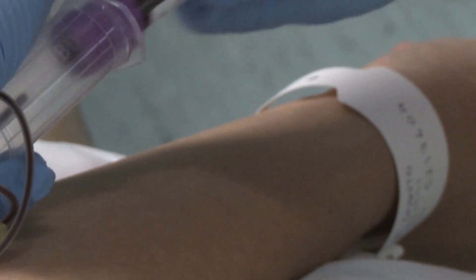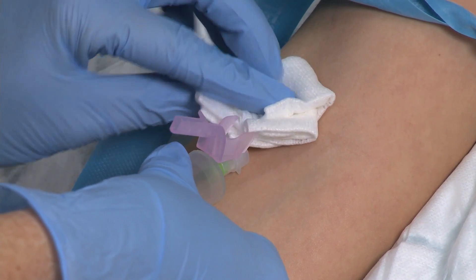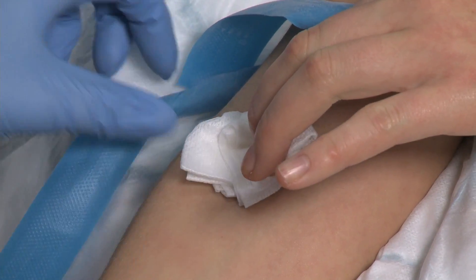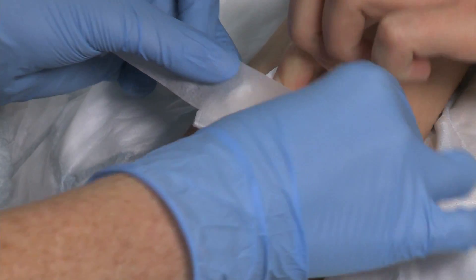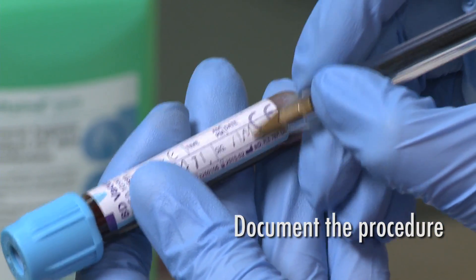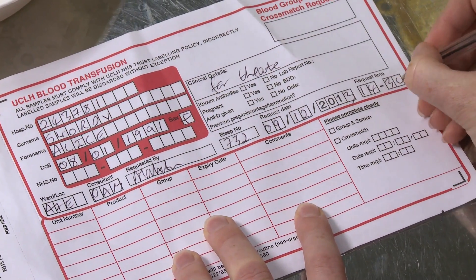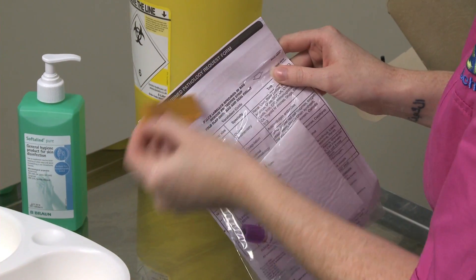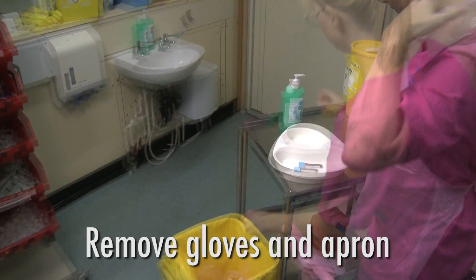Gently agitate the blood bottle in order that the sample mixes with the additive. Place the gauze over the puncture site and carefully remove the needle. Apply pressure to the site and dispose of your sharp into the sharps bin. Apply an appropriate dressing to the site. Please ensure you document this procedure in the notes. Most trusts require that the information on the blood bottles must be handwritten. The bottles must be accompanied by the appropriate request form. Dispose of any waste, remove apron and gloves, and wash your hands.